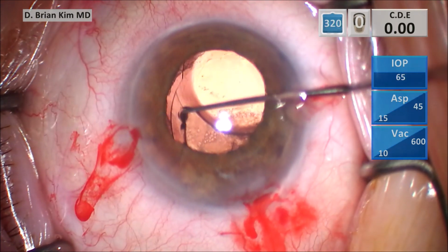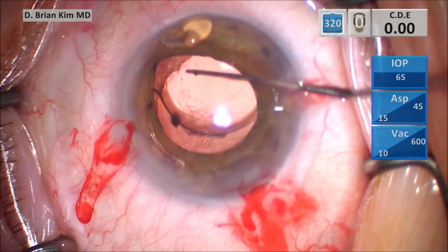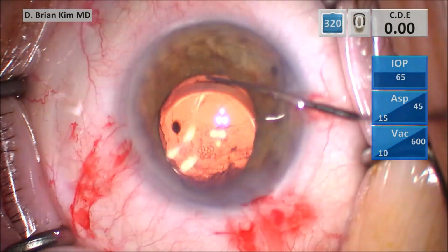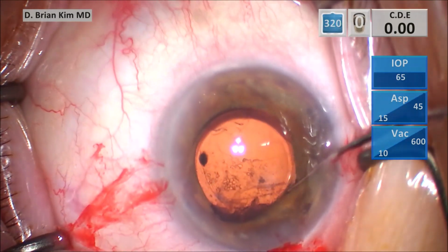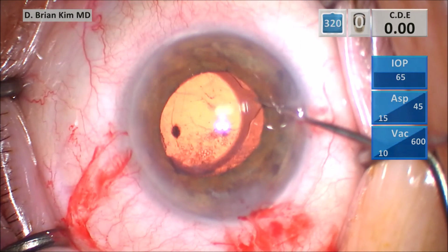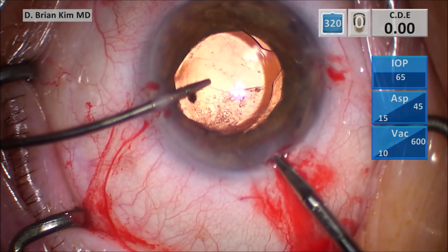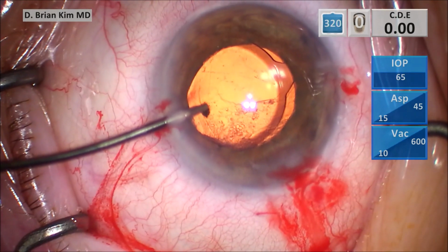I'm able to pop that haptic very easily into the anterior chamber, again confirming that the haptic was in the sulcus. And then now I'm ready for the explantation. Again, with these gummy lenses, they're rather easy to explant.